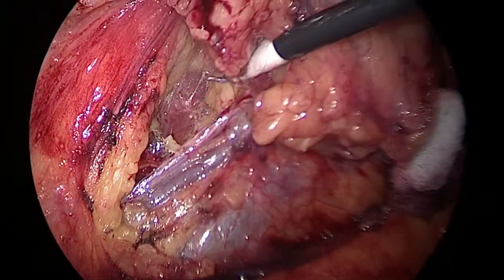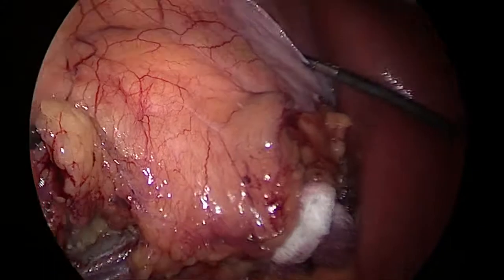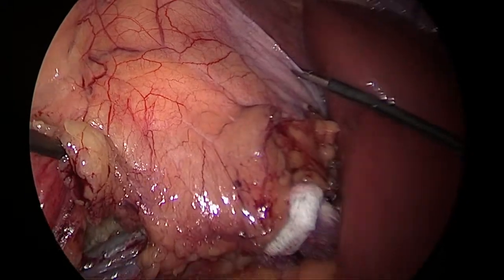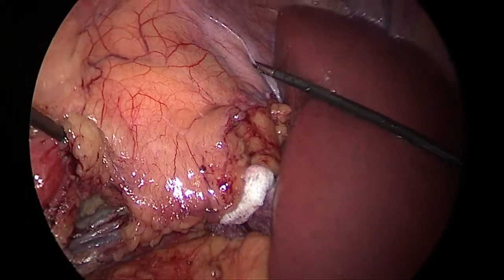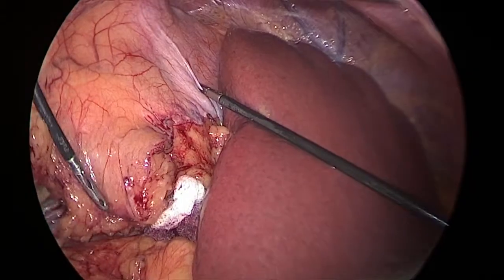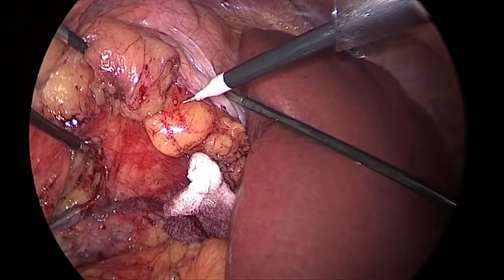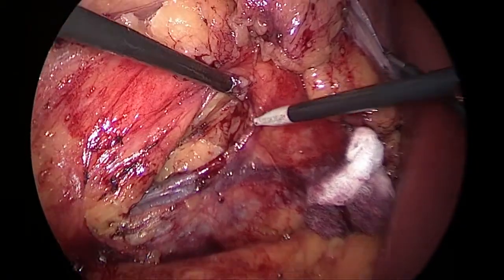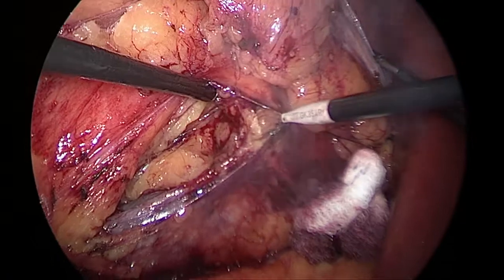In case of radical nephrectomy, we elevate the gonadal vein along with the ureter and follow the lateral border of the IVC and easily reach up to the hilum of the kidney. In this case, I did not omit any steps of the operation. I just increased the speed of the video 1.5 times.